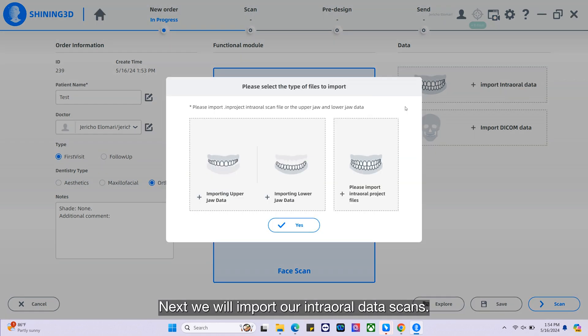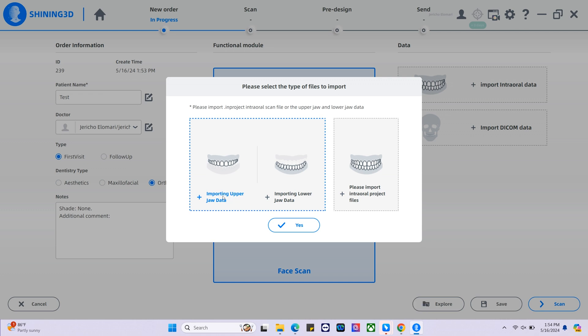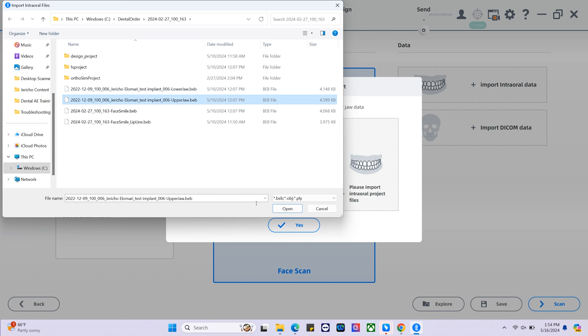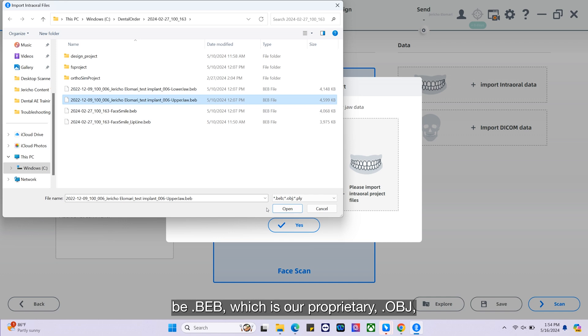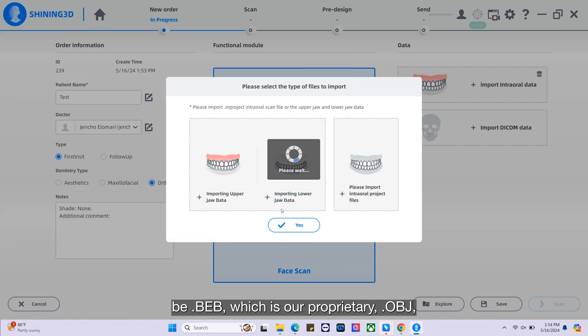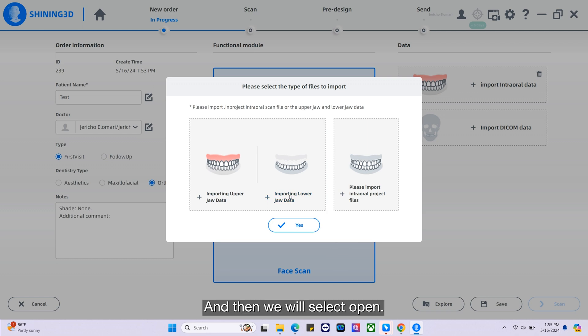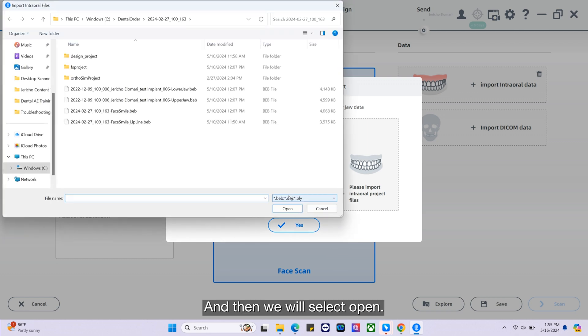Next we will import our intraoral data scans. Selecting the upper first, the import file type will be BEB, which is our proprietary file, OBJ, and PLY. And then we will select open.